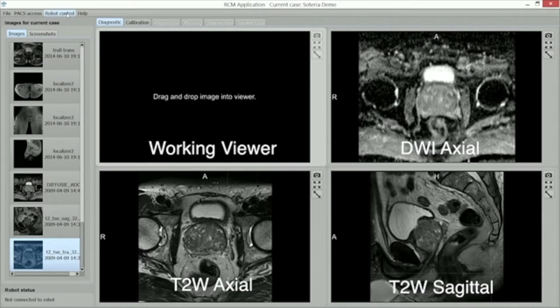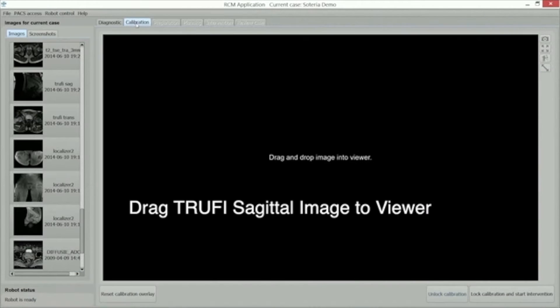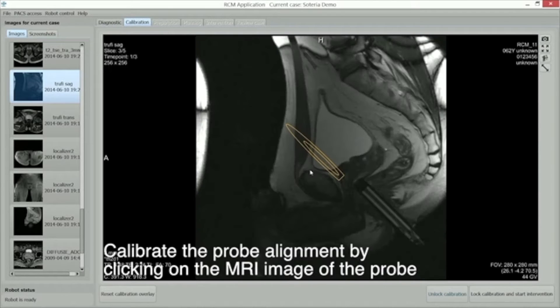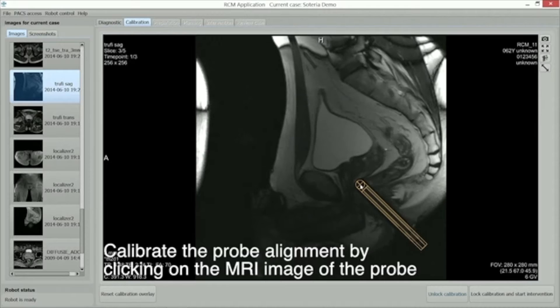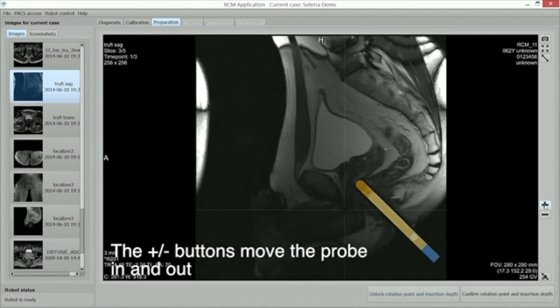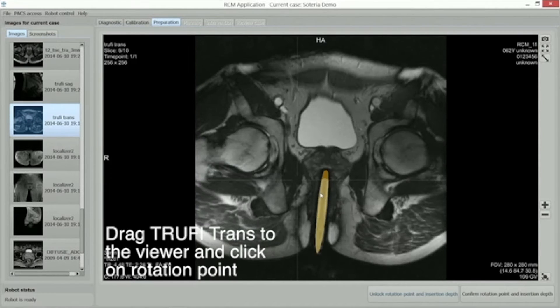The diagnostic MRI is retrieved and inserted into the robot software. A sagittal scan is carried out and dragged to the computer image. The probe can be calibrated by clicking on the MRI image of the probe. The calibration is locked by clicking on the button at the bottom right hand screen. The plus minus buttons adjust in and out of the probe. A transverse or axial scan is carried out and dragged to the screen.